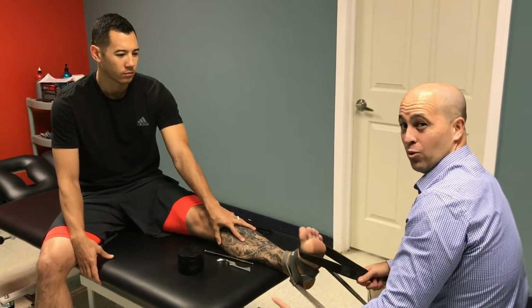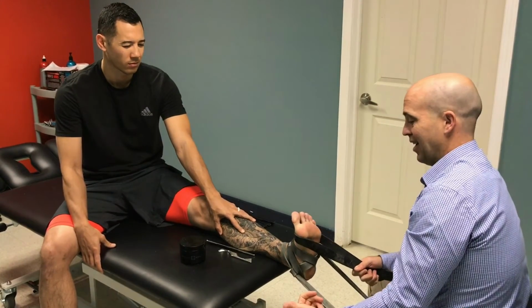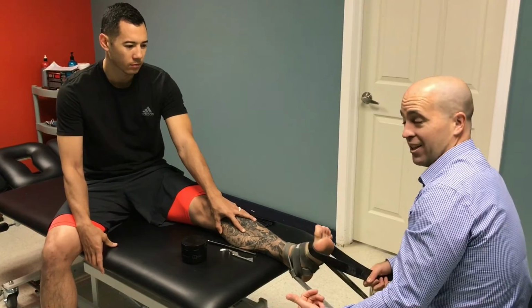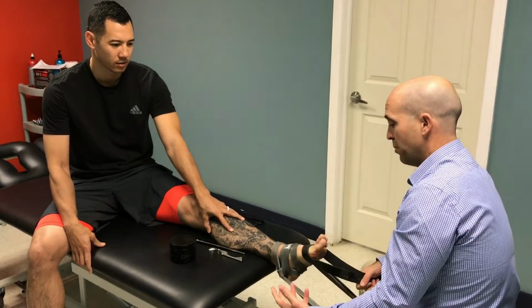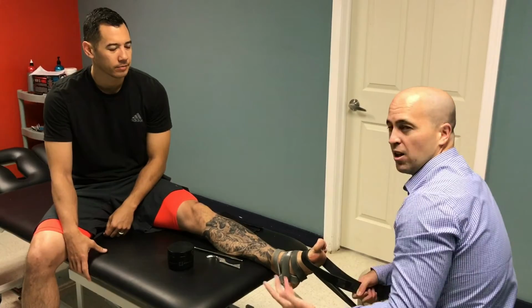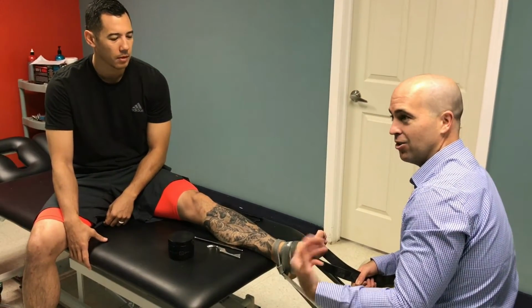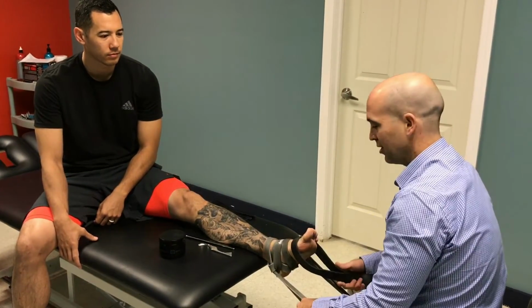Showing you this quickly, but you'd want to do this based on what the patient needs and how severe the strain was. He can tell you, it gets tiring pretty quickly and you really get those muscles firing. Did it hurt around the swelling that first day that you did it at all? A little bit. You want to try to minimize that if you can. It's swollen and it's aggravated, so a little bit of aggravation is okay. The benefit outweighs the risk, basically.